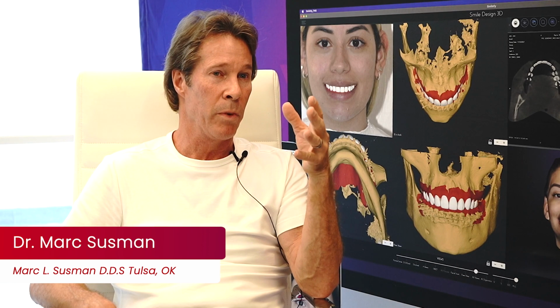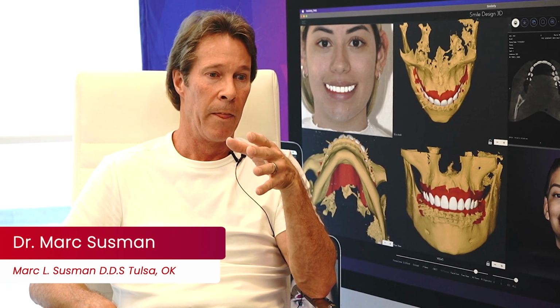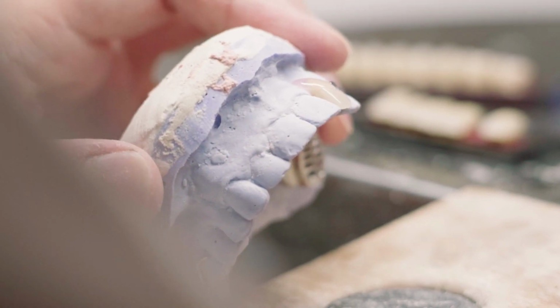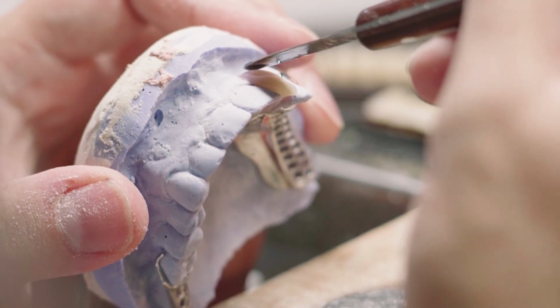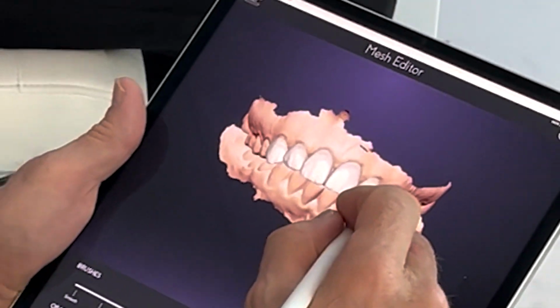If you're thinking about doing this, the time to do it is, as they say, now. Because right at this point in the career of dentistry, for most people, even the young people, they're going from the analog, which is just plaster models, articulators, wax plates, all that stuff, and we're going into the digital.